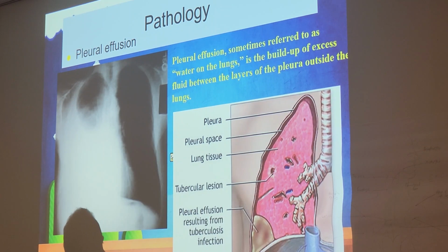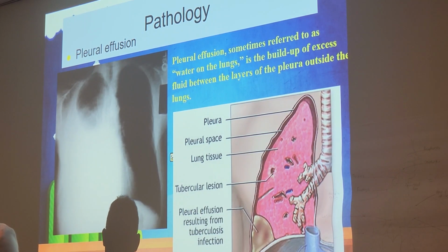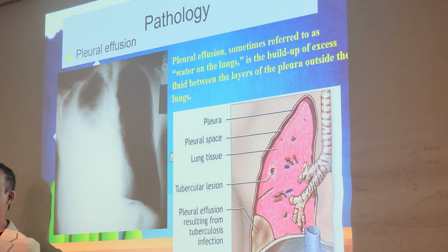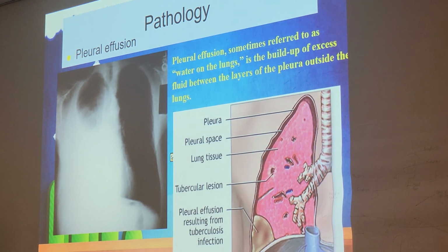So what would we do? Keep them below the chest. You hang it on the bed below the chest still. They usually have a little hook that you hang them on. The main thing is always keep it below the chest so that that retrograde action is still pulling the fluid out. You never put it on level or above. Because what would happen if I took one of those devices and I held it up? Probably it's going to go back in. And of course, we're going to probably be having to look for another job too. Don't be having that fluid go back in the patient's chest.